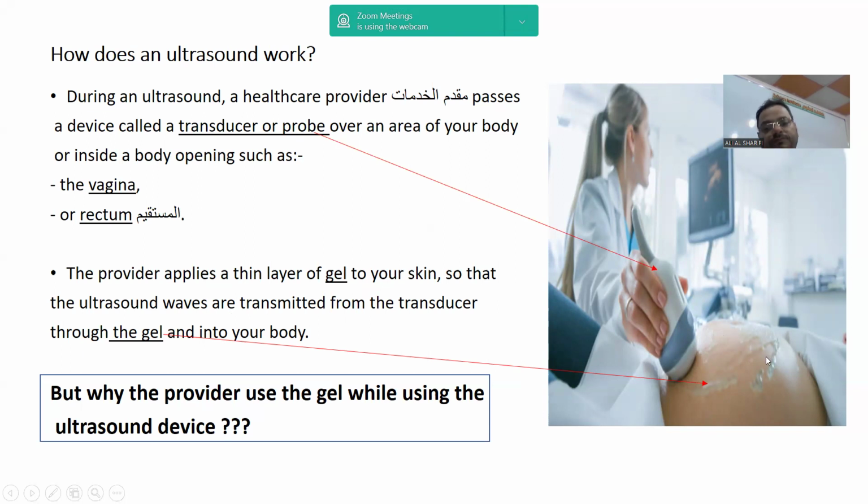That means the high frequency ultrasound waves will go directly and deeply to the specific soft tissue you are working on or want to test.